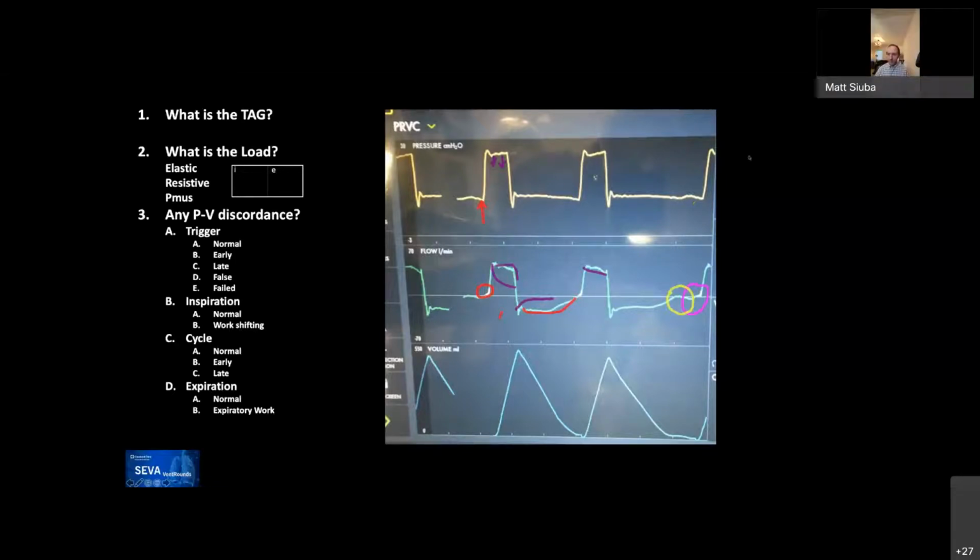And then Dilip asks, Rob, is the time controller something that can be turned off? I'm not sure what that means. The deflection drop that happens in the servo ventilators right at the beginning of exhalation, the time gain controller thing, the one that causes the notch at the end of inspiration.